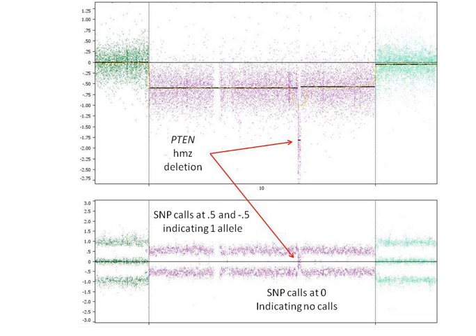And the PTEN homozygous deletion I show here was beautifully seen using our software which we use in our lab. We use Nexus Biodiscovery as well as the CHAS software, which now can be used for OncoScan.